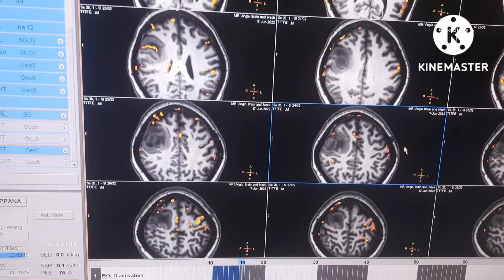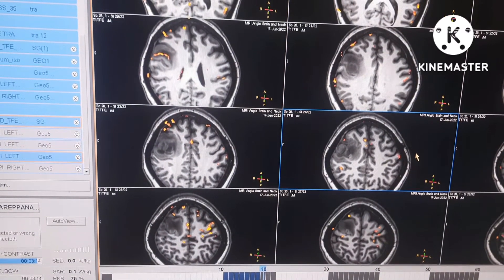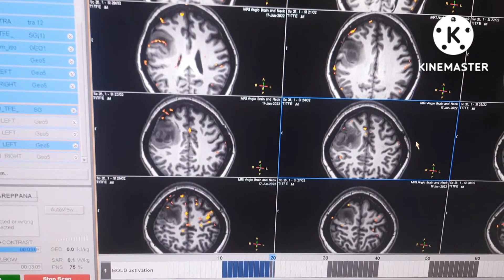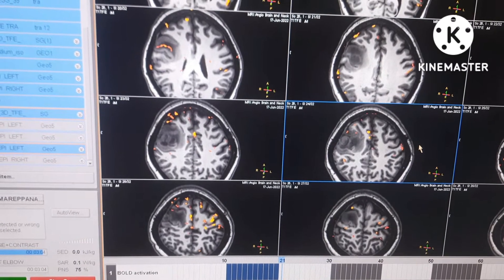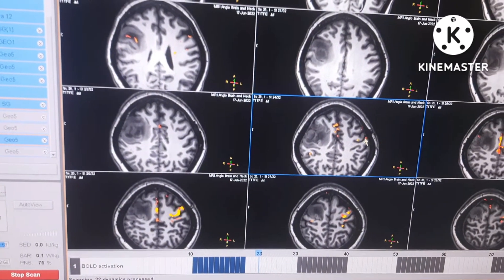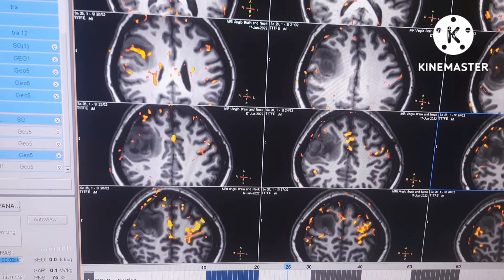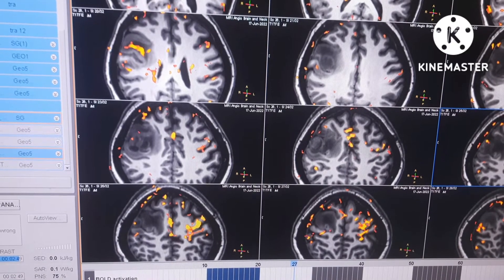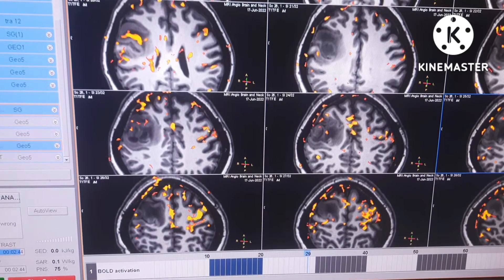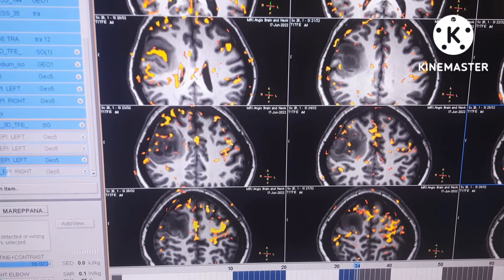Otherwise the person who is helping will affect the results — it will show incorrect changes. Now the patient will be in rest condition with no movements. You can see there is activation on the left side because we are performing for the right elbow. You will see the activation in the left parietal lobe.